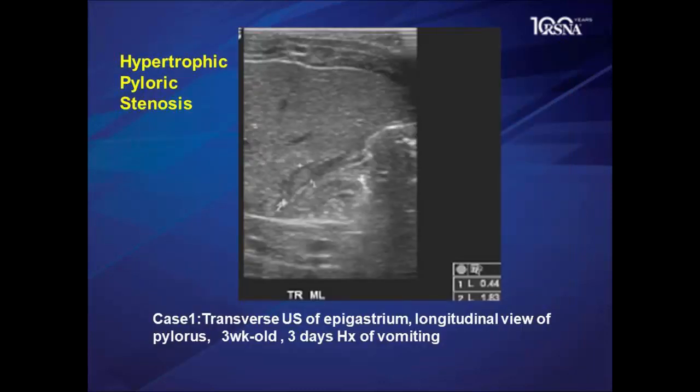Nowadays, ultrasound is the gold standard. Usually, a pyloric stenosis would look at you when you do just a survey with a convex probe, but we favor a linear probe with a high frequency, using the liver as a window. Technically, you look for the location of the gallbladder, and the pylorus would be there.